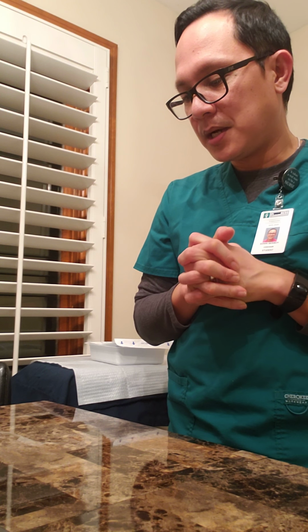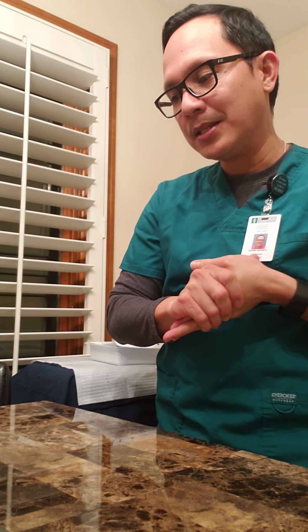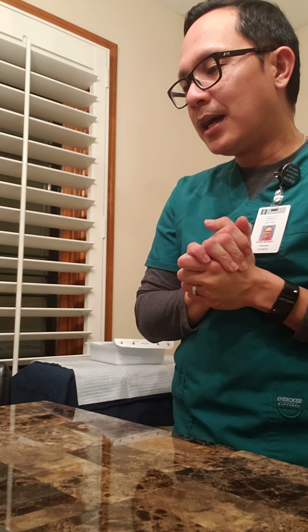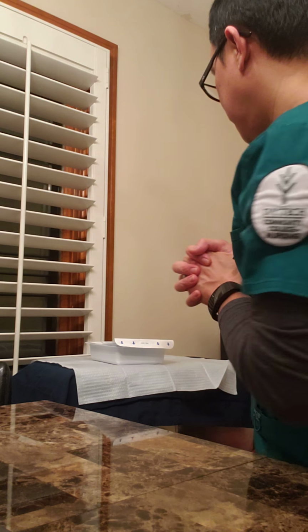At this point in time, I'm now ready to take off the old dressing and start the dressing change. If the patient cannot move his head to the other side, we can also have him wear a mask. Okay, thank you very much.